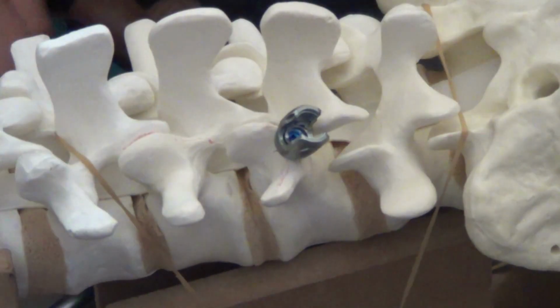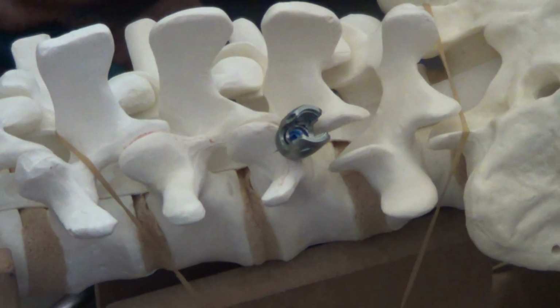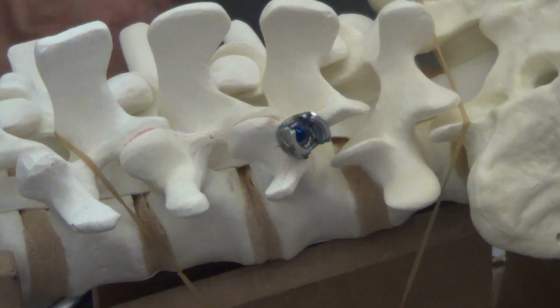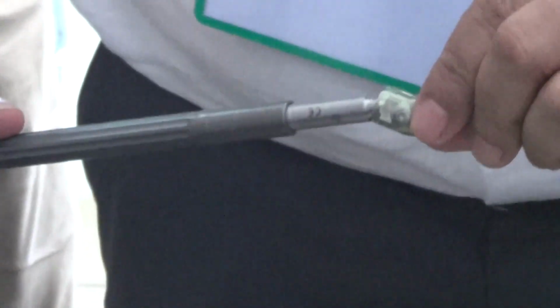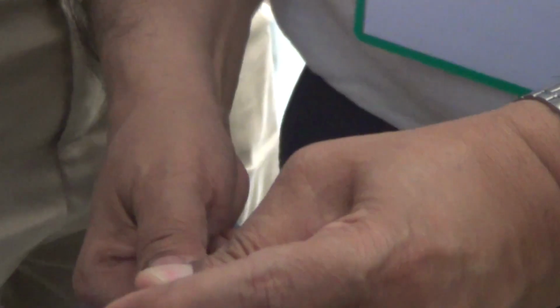These polyaxial screws have 30 degrees angulation on either side, so you have more play around it. You're not pushing it in because it's polyaxial. You can't drive it in. For driving it in, you have to lock this. The mechanism is movement here. So what you are doing is moving it like this. It won't go in unless and until you lock that mechanism. Then see, now you won't be able to move it. Then it will go straight inside. So what happens is this goes inside and locks that nut inside.